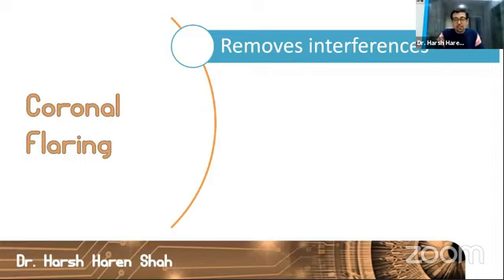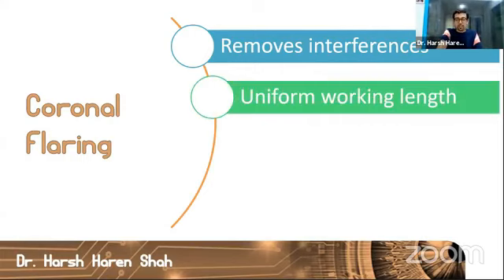What I mean to say here is, once you have done your orifice widening or your coronal flaring, all interferences will be removed. If these interferences were not removed and if coronal flaring was not done, there will be a high possibility of either separation of your instruments or a possibility of causing a lot of iatrogenic damage, causing endodontic complications. So please remember, coronal flaring is very important for removing these interferences.